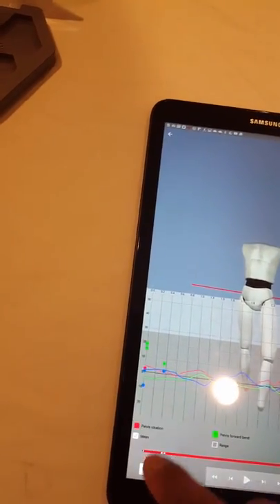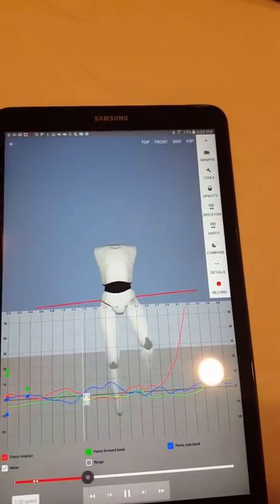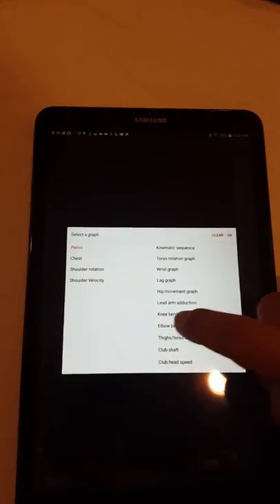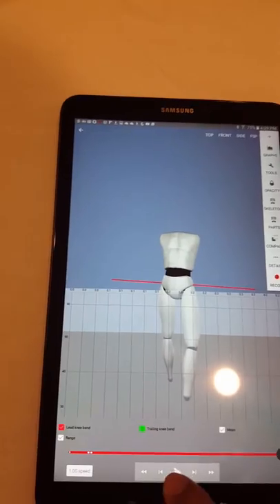So, let's turn on all the graph lines. Over here, we're looking at the movement of the hips. You can also look at knee flexion extension.